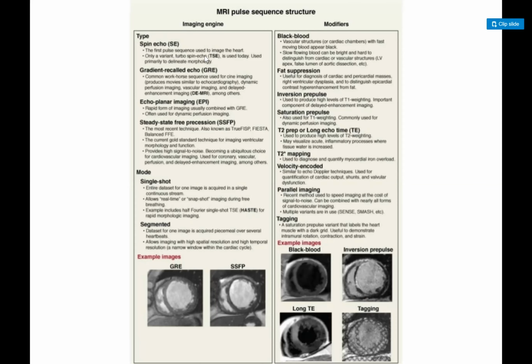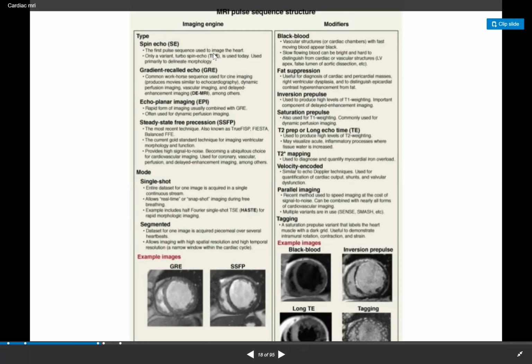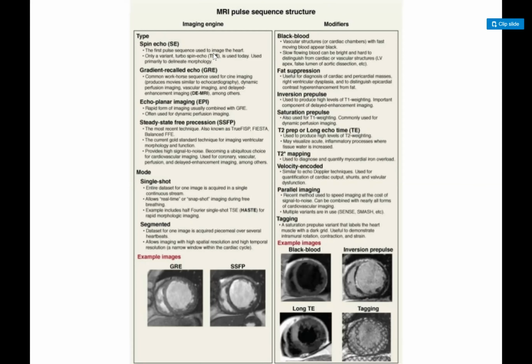What it's doing is creating a change in the spin, and there is what we call an echo train in the middle, which means there are increasing and decreasing levels of gradient applied on the body to obtain this. I'll go over why it is used and what the value of this is. But spin echo gives you very good spatial resolution. It's really good for morphology. You can see the structures really, really well.